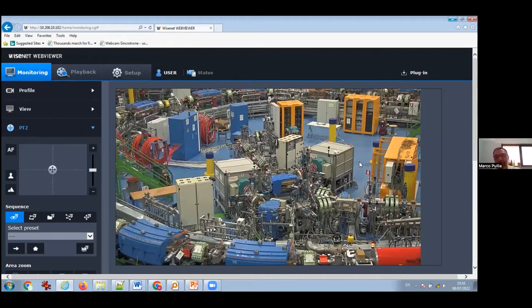It would be a temptation. And I'm not sure that it would be better in this respect. Having them inside, we ran smoothly. We didn't have very often problems with the sources, and I have the impression that if I had the possibility to access them, while you're playing with the protons, you want to open the carbon source and change something. I'm not sure that it would be operationally wise.